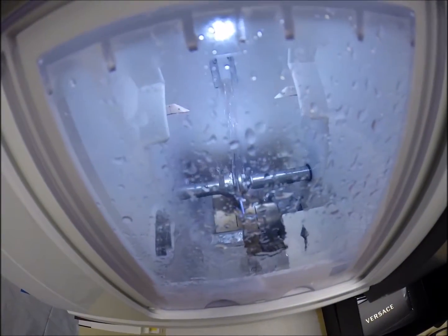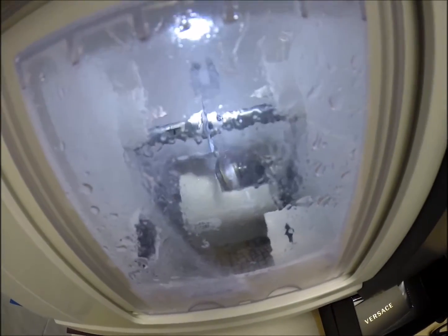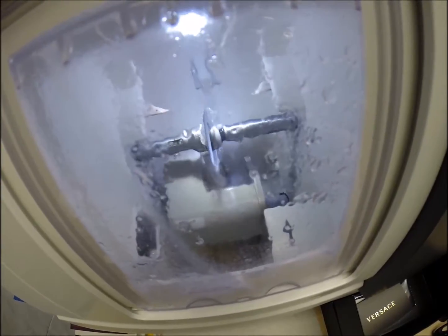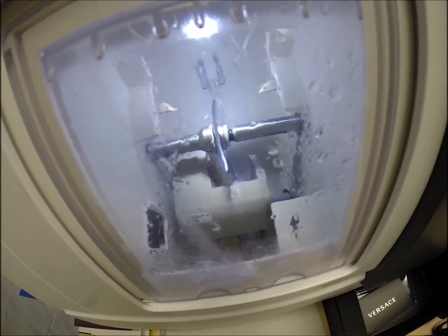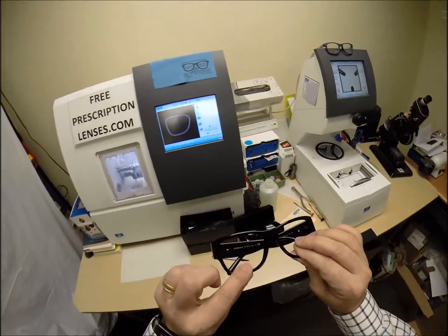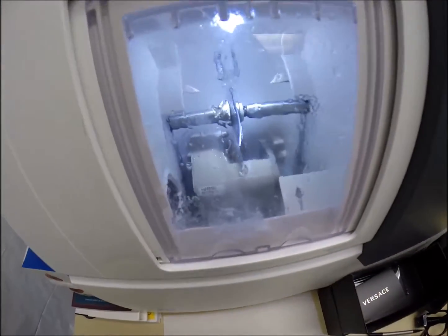Now the third feature, okay, you see water spraying onto the lens now. It tells me it's in the last 20 seconds of the cutting cycle. In just a moment, a little lever is going to come out. At the end of that lever is a spinning wheel, something you would find at the end of a Dremel tool. That's what's going to apply the safety bevel to the rear concave surface of the lens. So as I press it into the lens, I do not want any rough or sharp edges to come in contact with your frame.